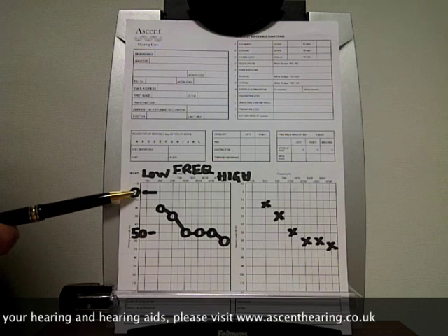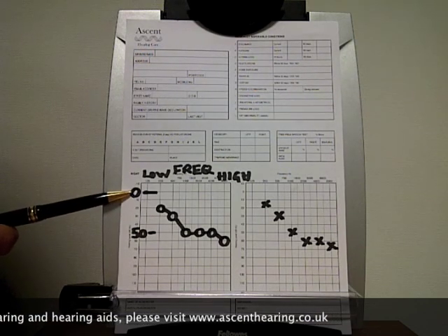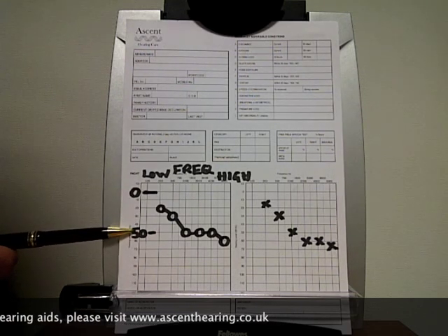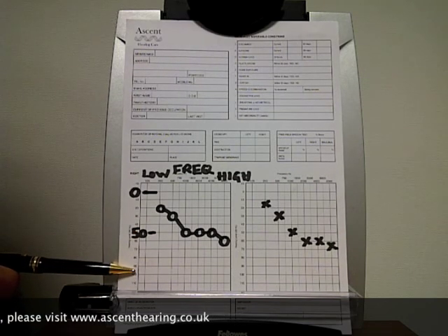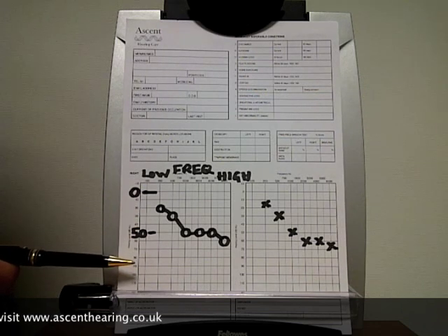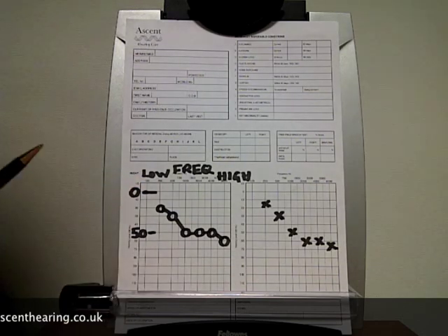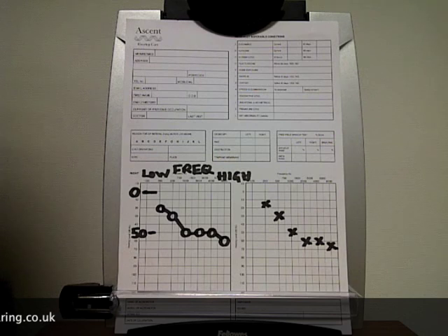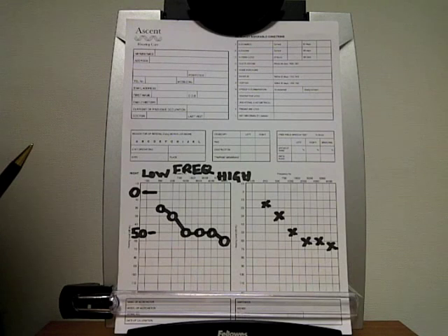On this scale it runs from 0 dB, which is normal — I'll explain that in a minute — as you can see here, 50 dB and down here 100 dB. These are the intensity levels that the client requires in order to just hear the signal. When we do a test using headphones, as I showed you in an earlier video, we determine the thresholds and record them on this chart, which we call the audiogram.